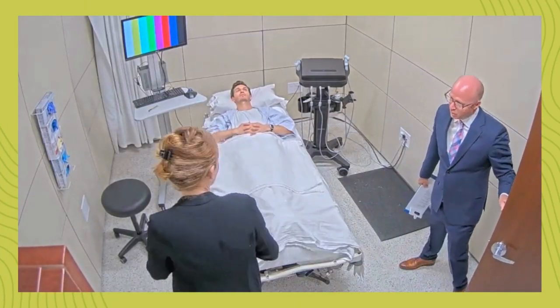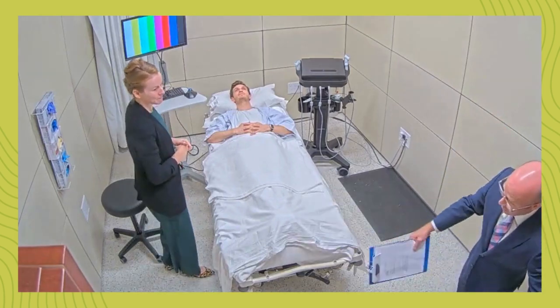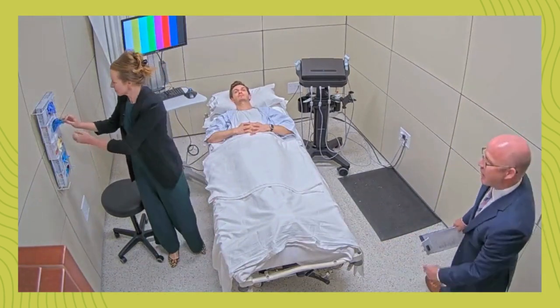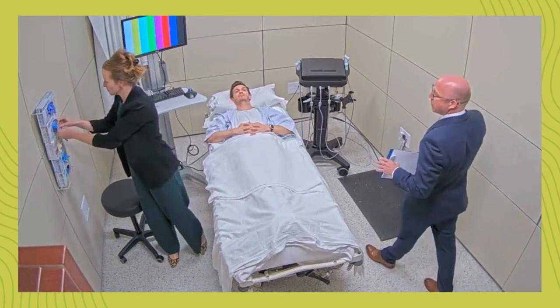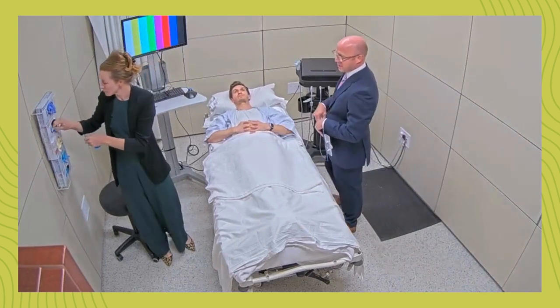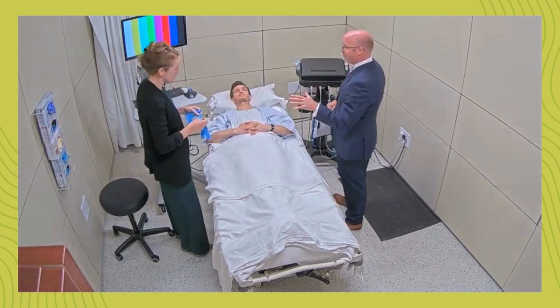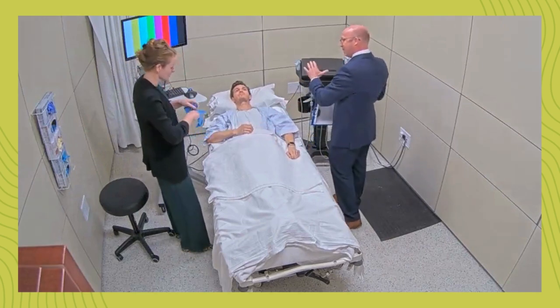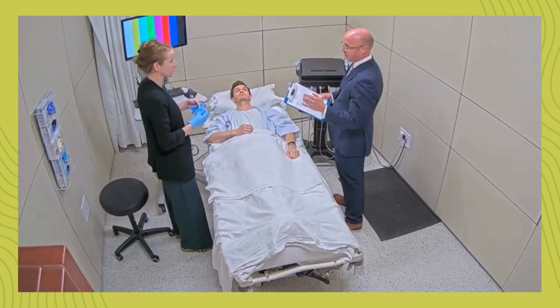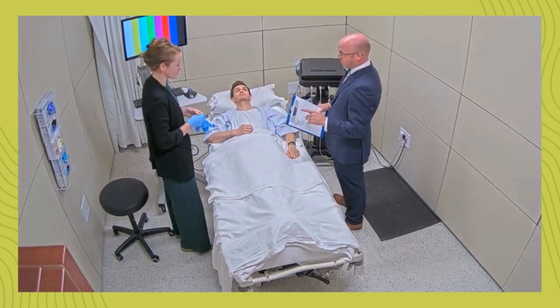Hi, Doctor. I'm Dr. Green. Welcome to ABEM General. Please help yourself to a pair of gloves. I'm going to be your examiner for this 10-minute ultrasound case. Just a quick reminder: with the ultrasound machine, I'm happy to change depth or gain, or help you position the bed to your liking. Before we get started, do you have any questions for me?